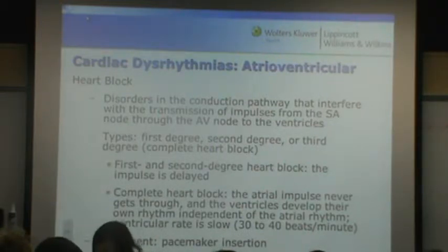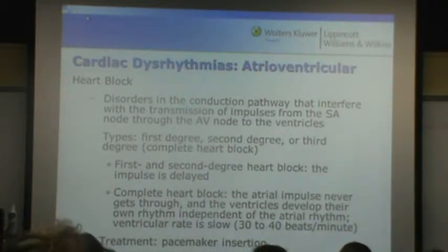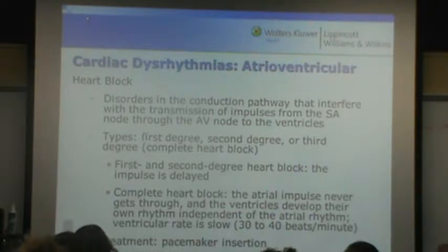Can you determine when it's going to be regular again? No. Okay. So it doesn't have a P wave. QRS is going to be narrow like that. But it's irregularly irregular. Yeah, atrial fibrillation.